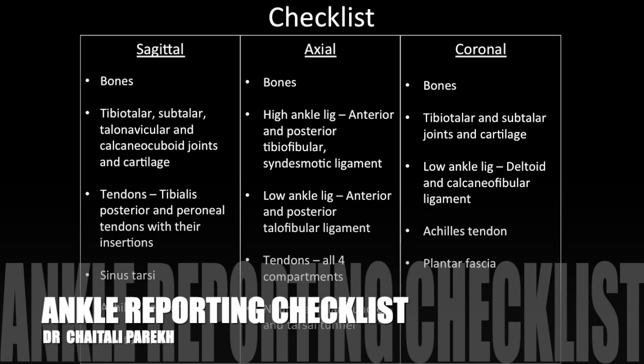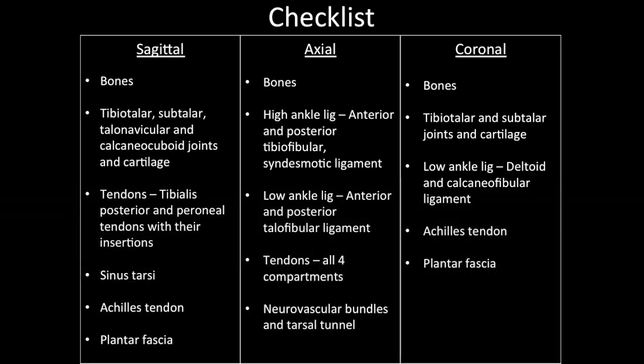We have discussed the normal appearances of structures in the ankle joint on MRI. This is a checklist of those structures which are better seen on sagittal, axial, and coronal images. But please make sure to look at these structures on other planes as well, particularly when you are in doubt whether they are injured or not.